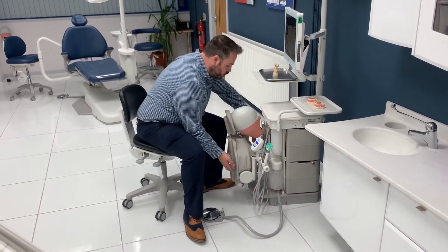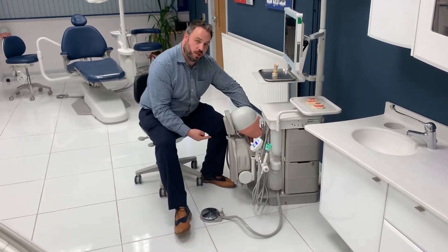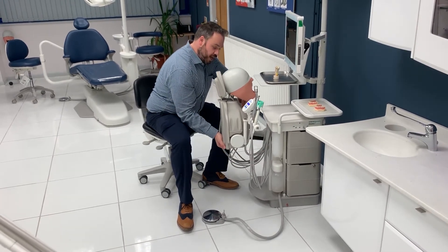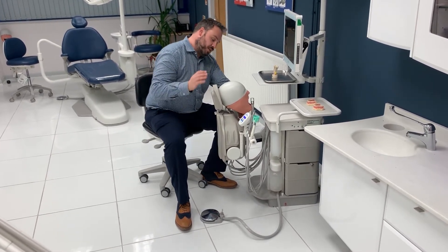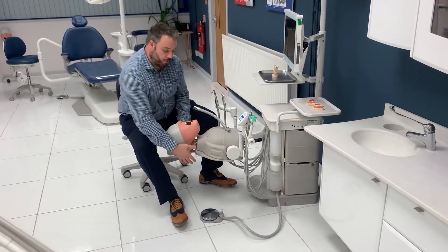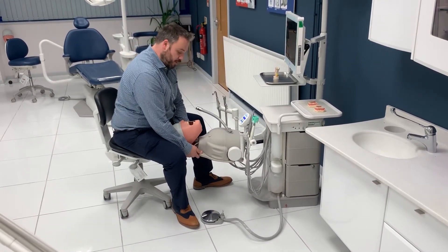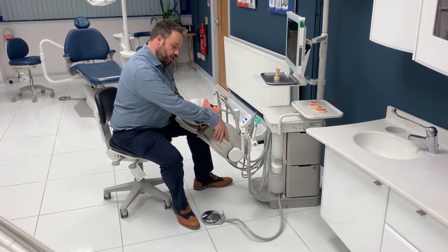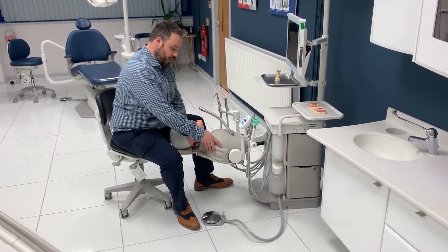To adjust the head, there are two buttons, and it's really important we use these buttons to make the adjustment. The first one has a straight line, and we use this button to move the head up and down. The second one has a curved line, and we use this one to articulate the head. It's really important that we're not forcing this phantom head without pressing those buttons. As soon as we press, the pressure releases, and we can articulate the phantom head.